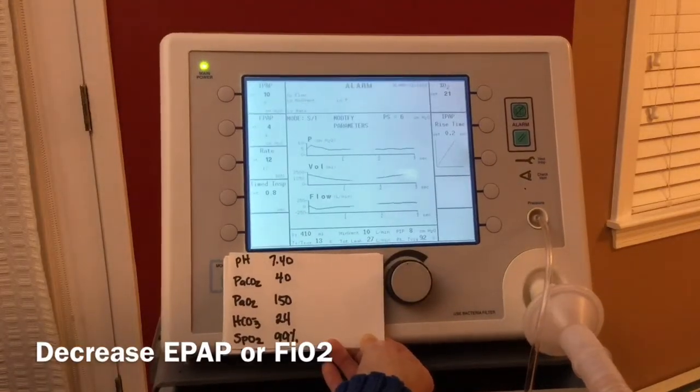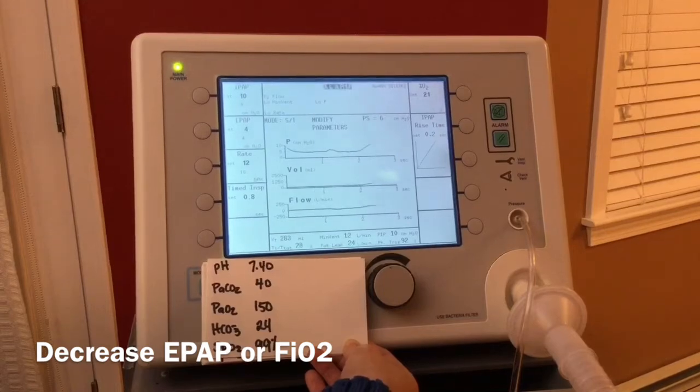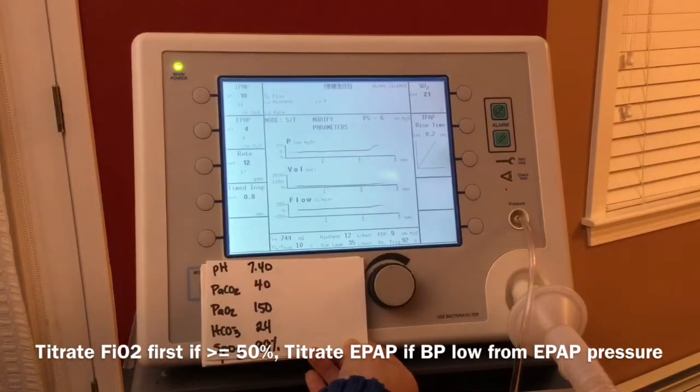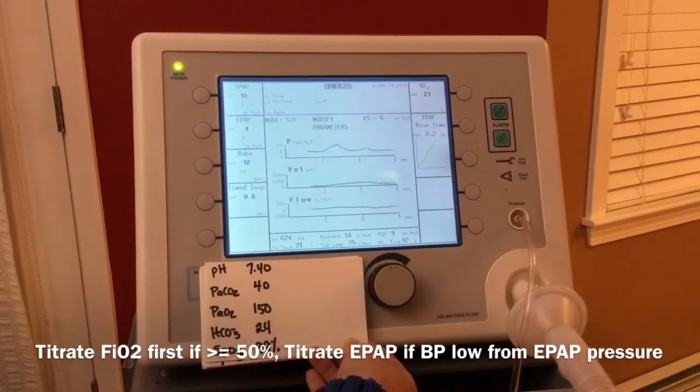It's not wrong to do a combination, but typically therapists will do one move or the other and then assess. And it really depends on how much FiO2 you're on. If you're under 50%, the likelihood to increase FiO2 will be the first move. If you're close to 50% or over, you would not increase the FiO2, you would increase the EPAP as long as blood pressure was stable.